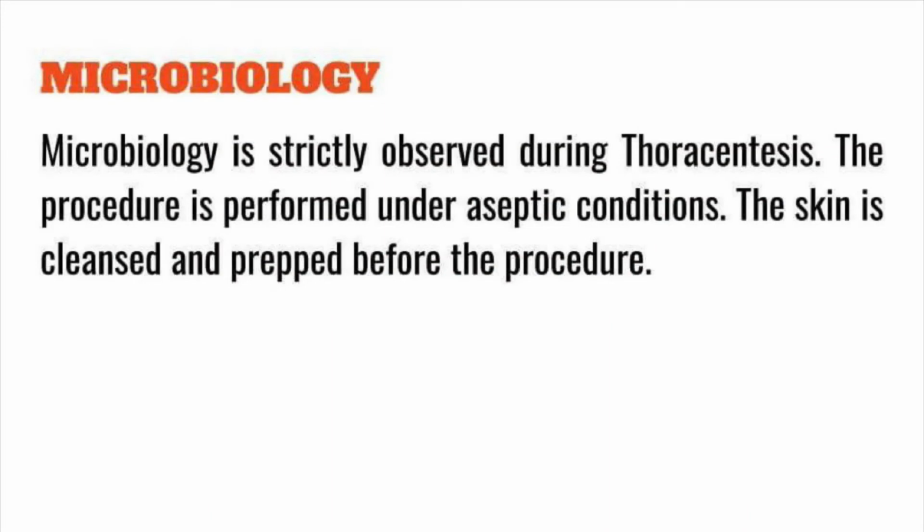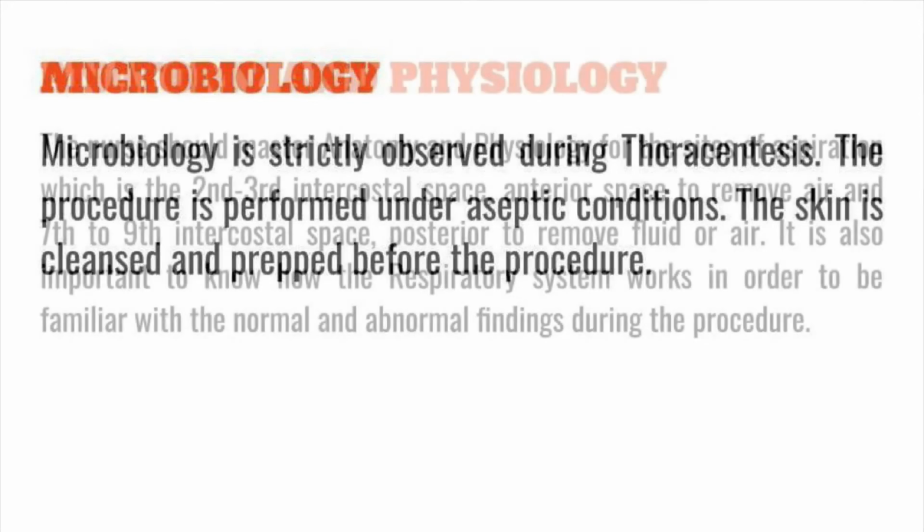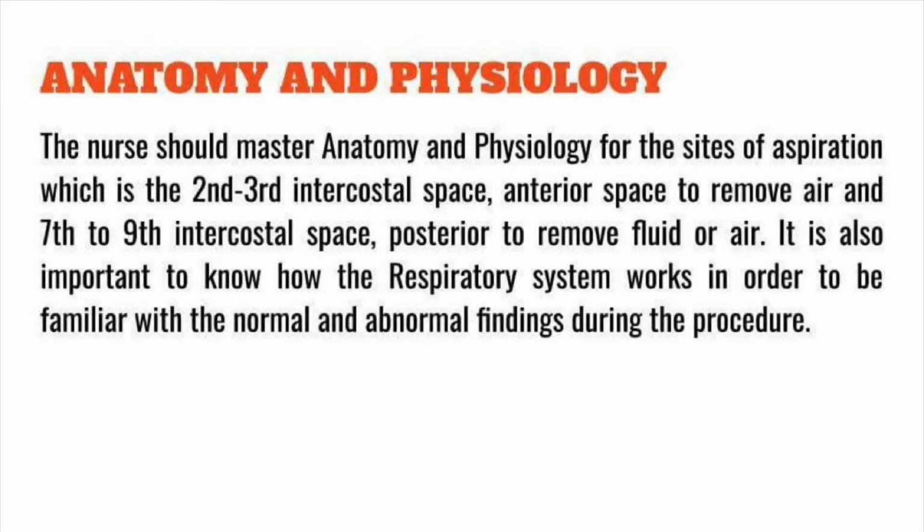The procedure is performed under aseptic conditions. The skin is cleansed and prepped before the procedure. Second is anatomy and physiology.